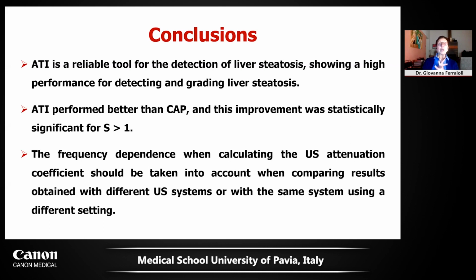We have to take into account the frequency dependence when we calculate the attenuation coefficient, because of this limitation when comparing results obtained with different settings, it is important to use different cutoffs with a different setting.